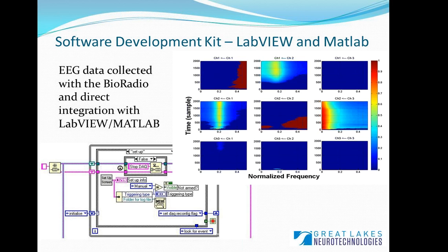So then, in addition to just exporting saved data files, you can also use our software development kit to stream data directly from the BioRadio into custom applications that you create or develop using LabVIEW or MATLAB. So we offer a really nice variety of flexible options with the BioRadio. So we're giving you wireless data acquisition for EEG, which is a great feature for a number of different studies. We provide analysis software packages if you need something that's more automated and kind of ready to go. And then we also provide the software development kit aspect to give you complete flexibility in what you may want to do with your data.